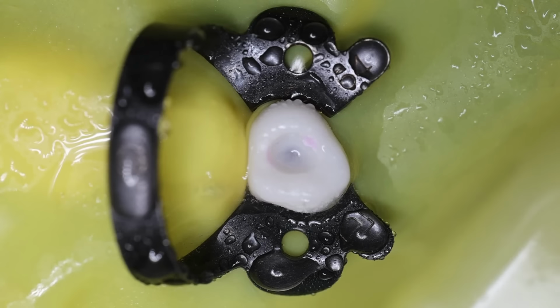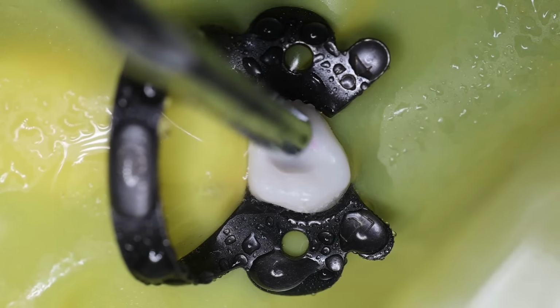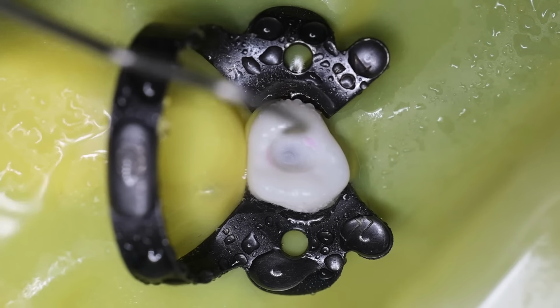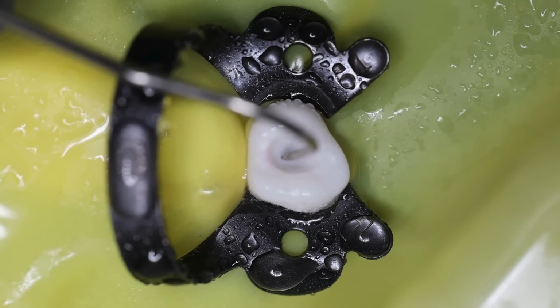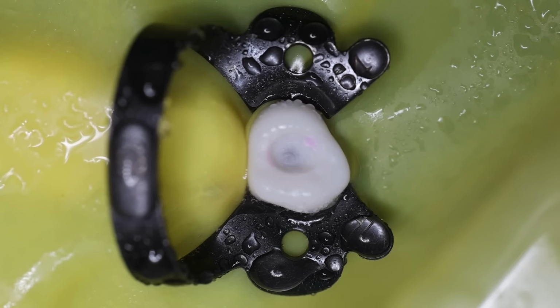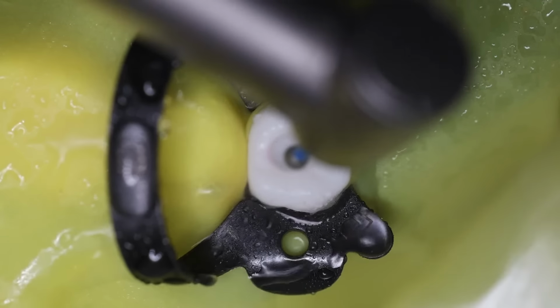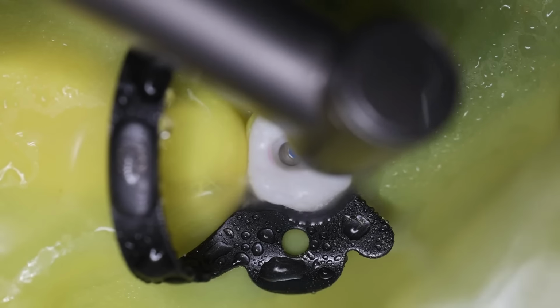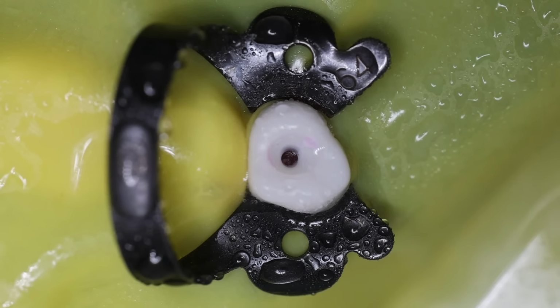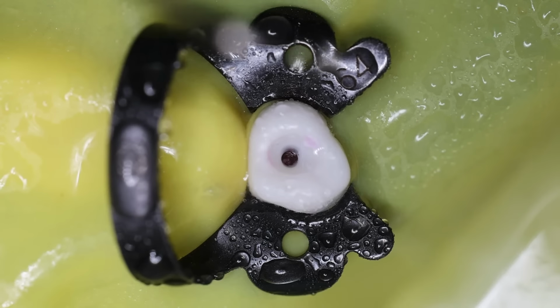Slowly now you can again see it. Just try to explore if there is any drop that you might feel. So this is basically the roof of the pulp chamber, that darker area. Once you puncture it, you will be into the pulp chamber. See, you just punctured it and it is now the roof of the pulp chamber. So this is the exposure.